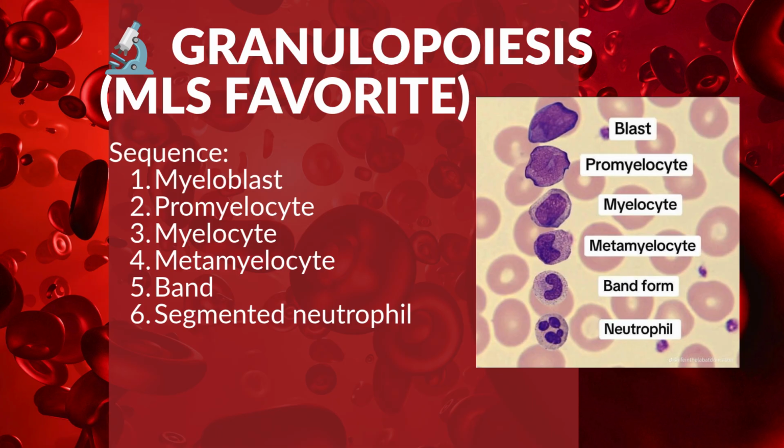The band neutrophil is the next one. Band neutrophils are immature neutrophils released from the marrow. It has a horseshoe-shaped nucleus, which it does exactly have. There are no true segmentations yet, and bands increase during infection and inflammation. So when we see this coming out, there's an increase in infection and inflammation. We don't want to see anything above this band. Why are you outside? This one here is just barely able to come outside while the street lights are still not on yet. The other ones need chaperones.